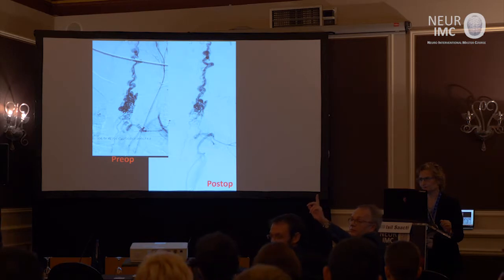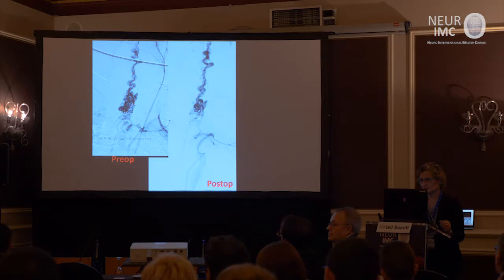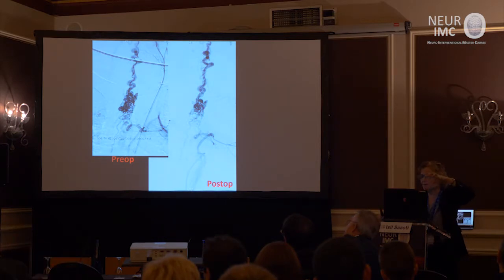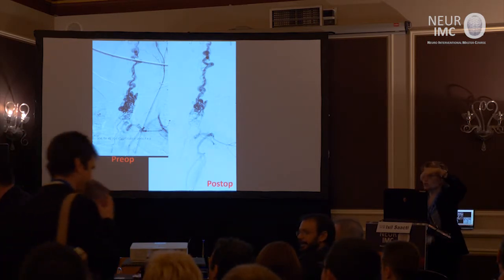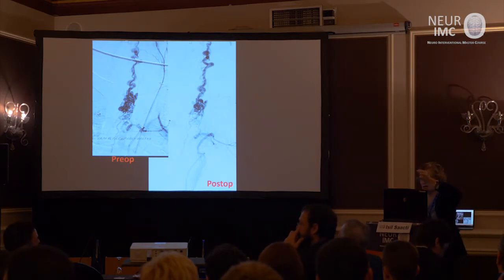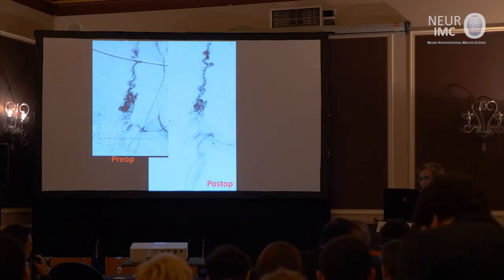Okay. I would be a little worried to go beyond the aneurysm, because once you've closed the AVM, now your flow is directly into the aneurysm. So you close the aneurysm by retrograde flow, because you are beyond the aneurysm. Yes. So you are closing the AVM, but the aneurysm is still... No. We came all the way till we closed the aneurysm. That was the idea. The first target was the aneurysm. However, we wanted to take advantage of going a little bit distal to the aneurysm, so that at least we can hit some of the AVM, and also there is not much segment proximal to the aneurysm before the anterior spinal artery. That was the safety reason, actually. That was the reason why we went distal.